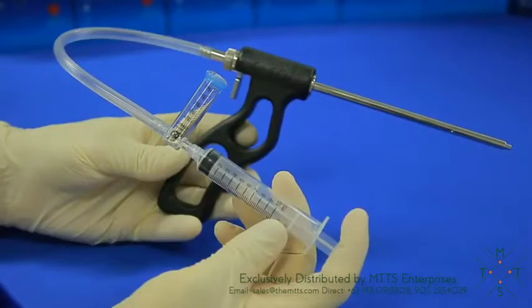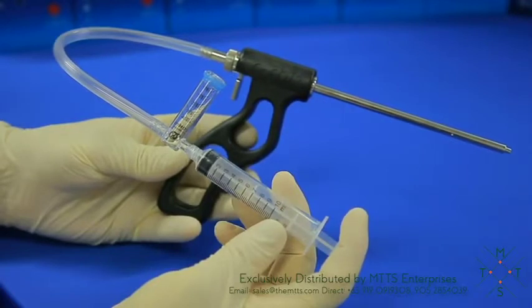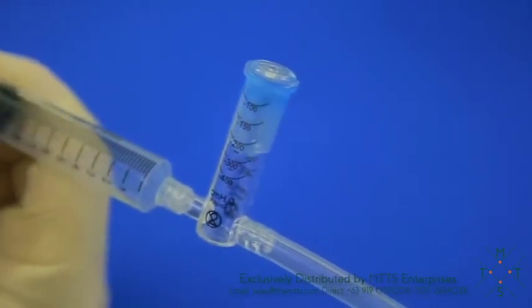The manometer is in minus centimeters H2O increments. It simply connects between the syringe and the tubing, and then the tubing is placed onto the handpiece. It has a blue diaphragm that will react when negative pressure is obtained and maintained.